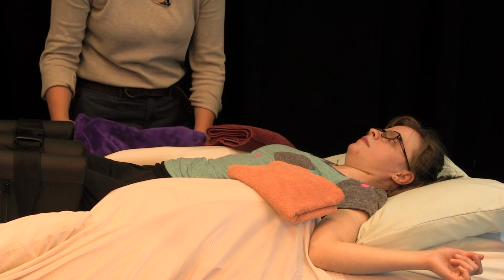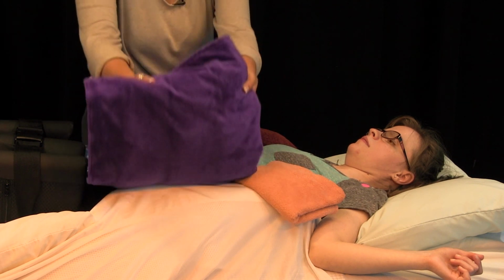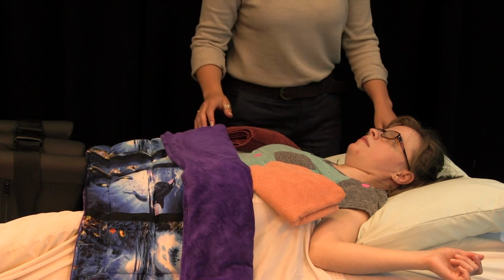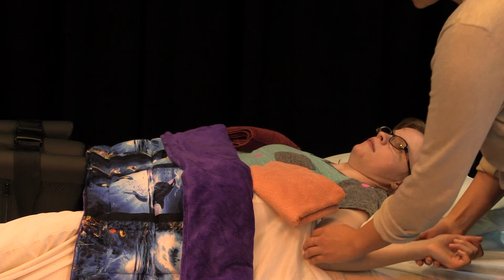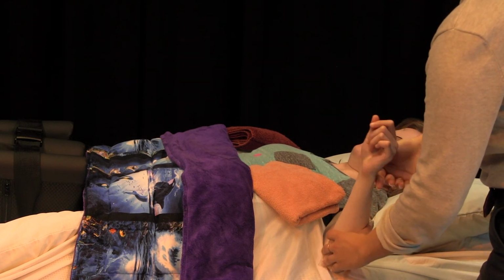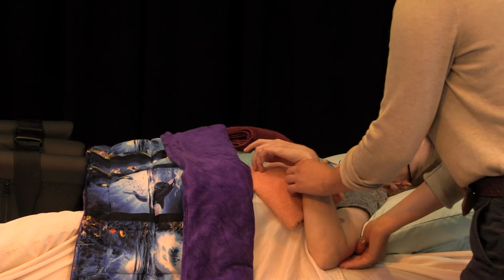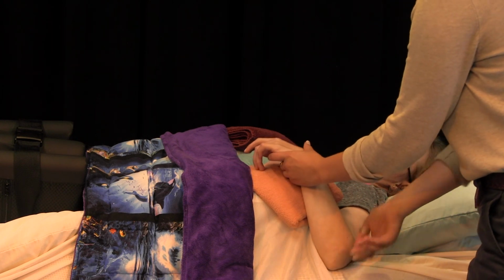And we will lay this weighted blanket out. And I'm going to come around to this side. And we're going to internally rotate her arms here and allow for some support. Do you mind if I pull your elbow out a little bit? Is that okay? Yep.